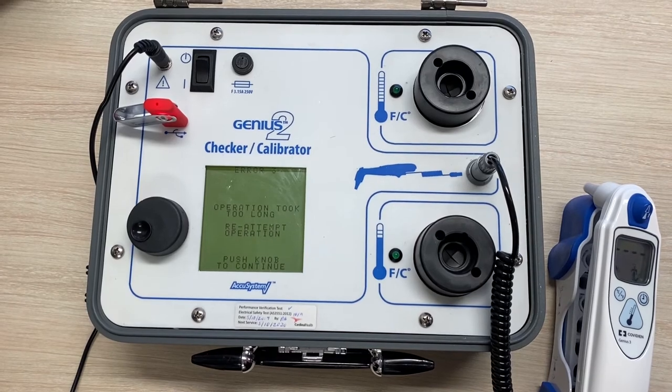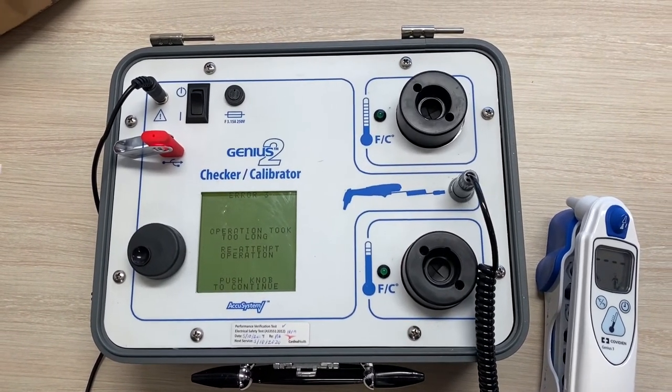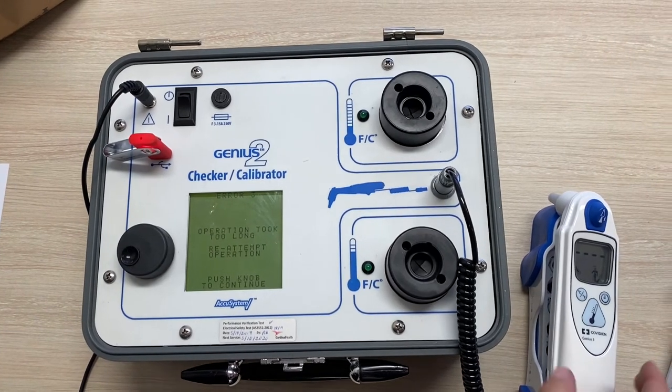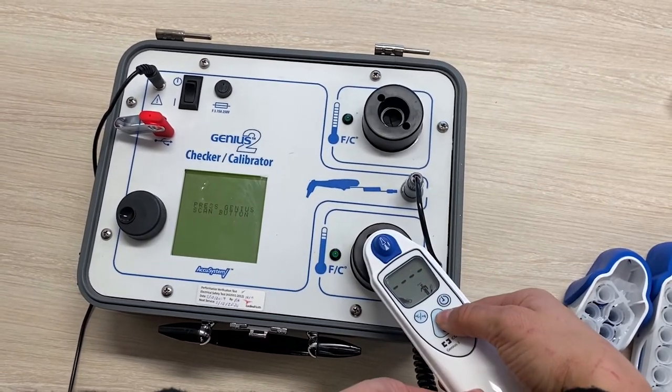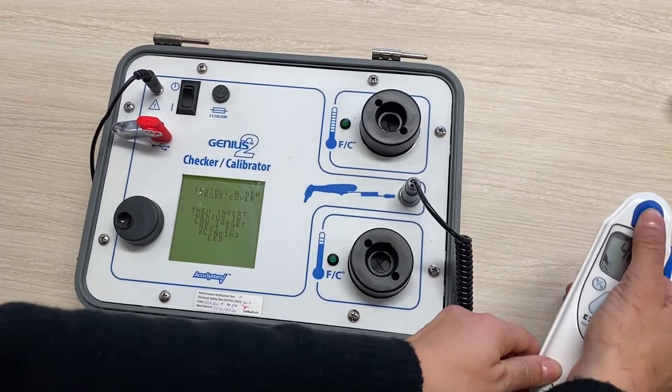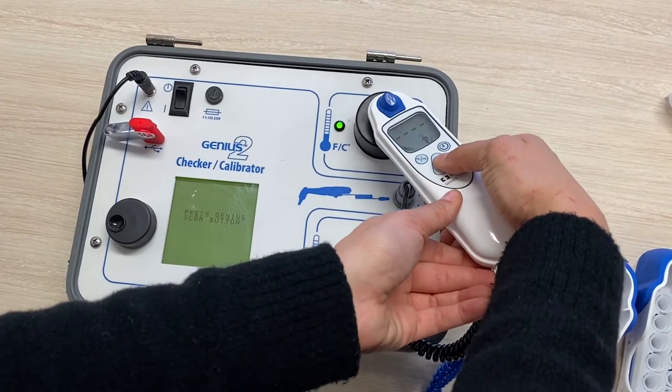If you take too long, you may get an error 3, but that's okay — just continue on, it will just mean you have to start again. As you can see, it's pretty straightforward. Flashing lights indicate which target to use, and there are prompts on the screen as well.